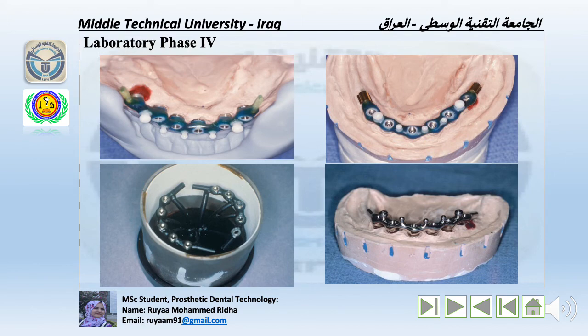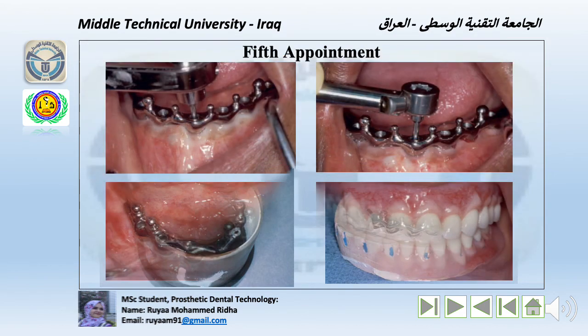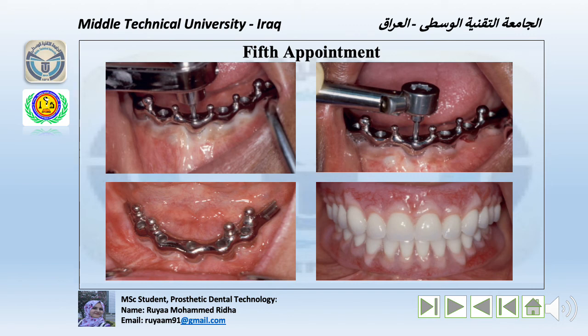Laboratory fourth phase, fabricating the casting bar. Fifth appointment. In this appointment, evaluate the casting bar in the mouth and verify passive accurate fit of the bar in the mouth.